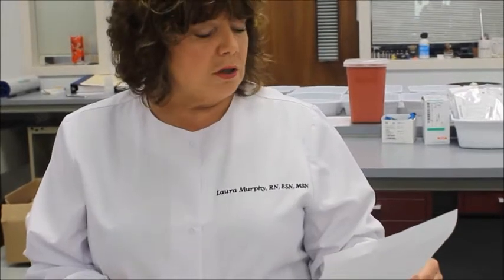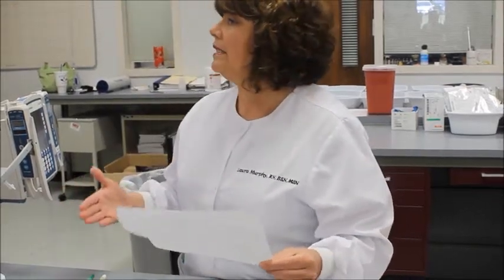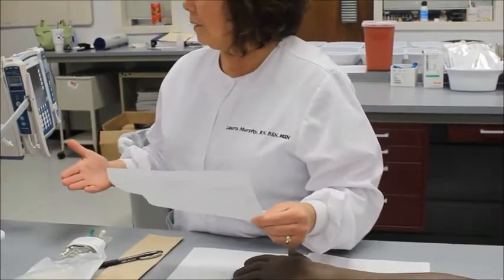So whenever you read your order, you want to pay attention to the fluid. This says admit to 3 South, start IV fluids, 500 cc's normal saline at 115 an hour. Okay? It then says to start oxacillin 1 gram IV Q6 hours. That is going to be my secondary, my piggyback med.